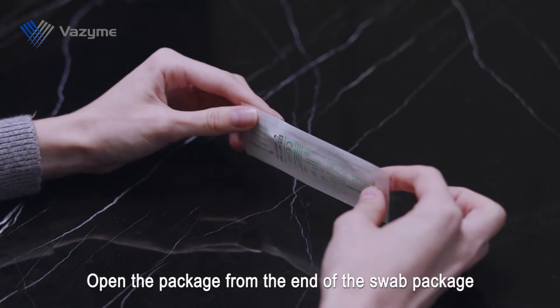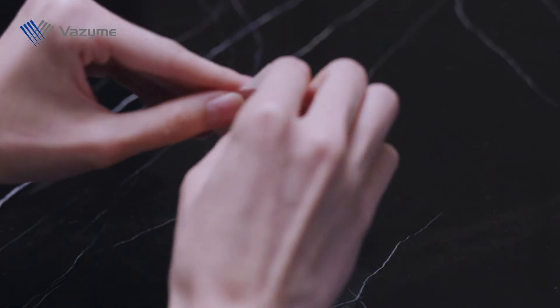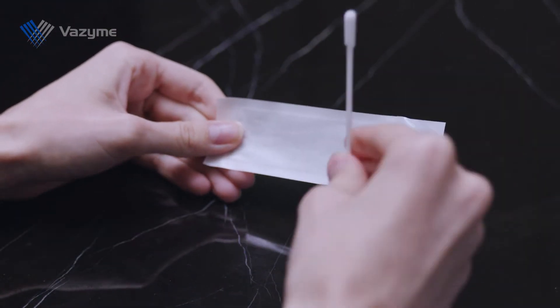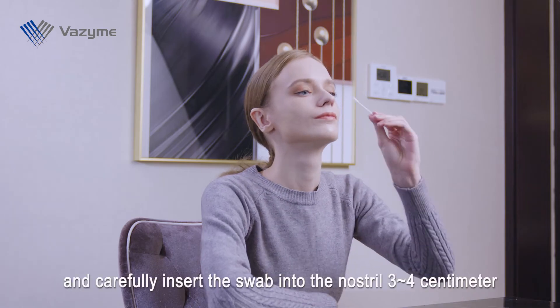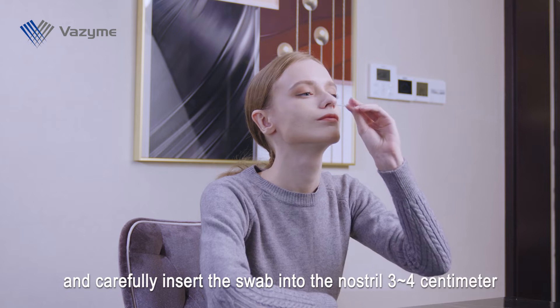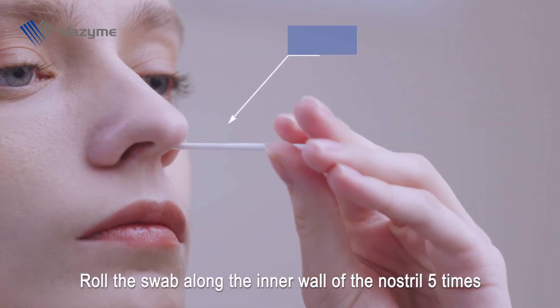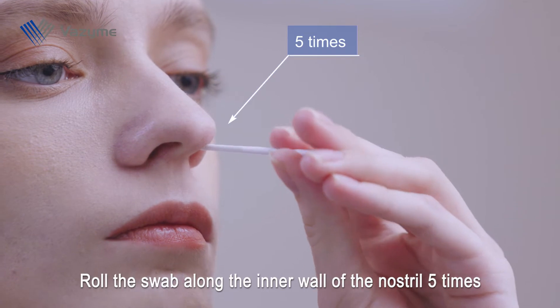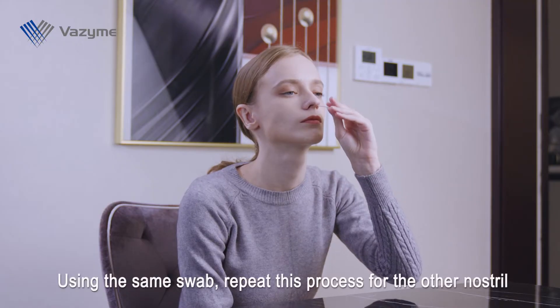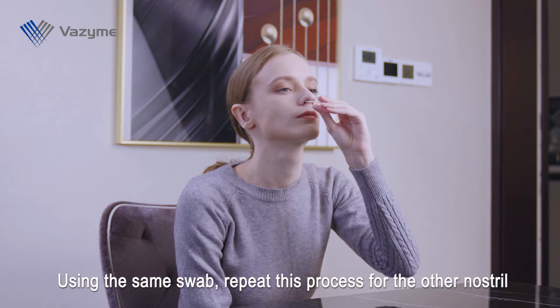Open the package from the end of the swab package. Carefully insert the swab into the nostril 3 to 4 cm. Roll the swab along the inner wall of the nostril 5 times. Using the same swab, repeat this process for the other nostril.